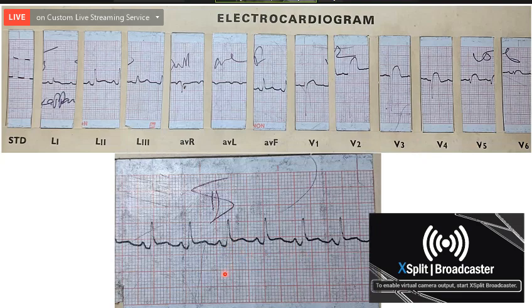PR segment. Acute pericarditis, PR segment depression. Yes, you can see the PR segment depression suggestive of pericarditis. So the full diagnosis in this patient would be acute anterior myocardial infarction associated with acute pericarditis. Very good.